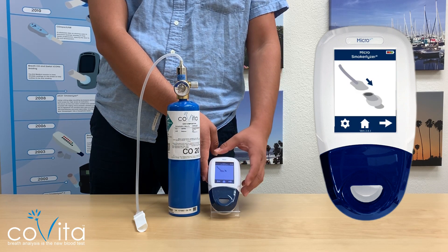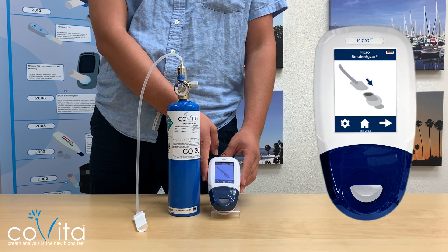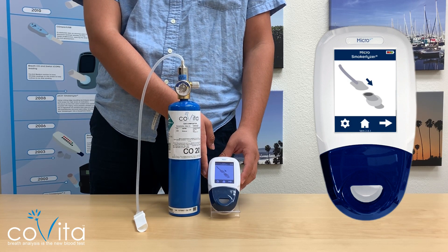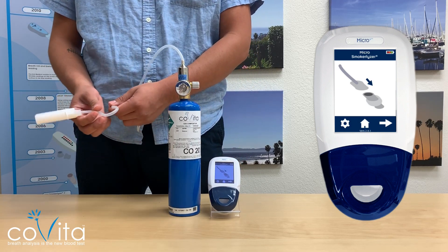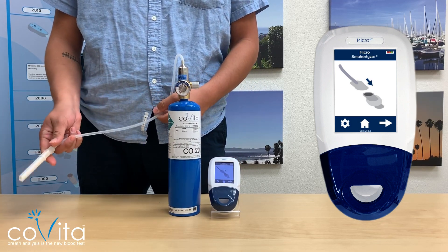Click the arrow below to move onto the next screen, which will display the D-piece being attached to the bigger end of the Cali adapter. Ensure there are no kinks in the tubing to prevent a failed calibration, and insert the D-piece into the monitor.